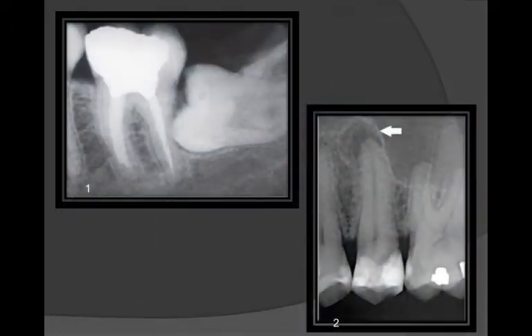Periapical radiograph for impacted third molar, to know the relation between factors affecting the third molar surgery, involving the external oblique ridge and anterior posterior relation to the ramus, vertical depth of the impaction, and number and morphology of roots. In the second image, periapical abscess, to know the extent and site of the abscess.